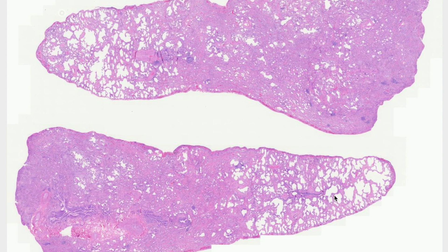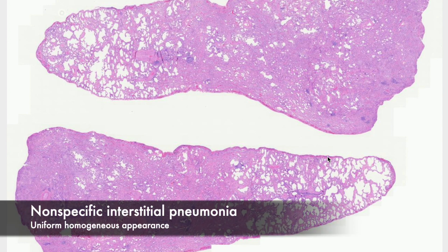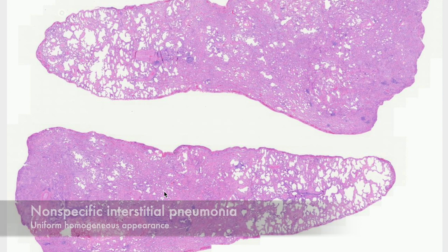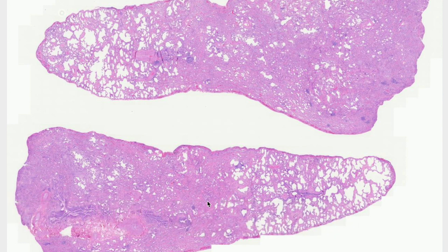In contrast to the previous case, this has a very homogeneous appearance. If we look starting from the pleural surface, going towards the center of the specimen and then back out to the pleural surface, it has a relatively uniform appearance, with really no accentuation underneath the pleura or around airways. Some areas are a bit busier than others, but this is actually just a bit of atelectasis that can happen to the specimen as it's being processed.